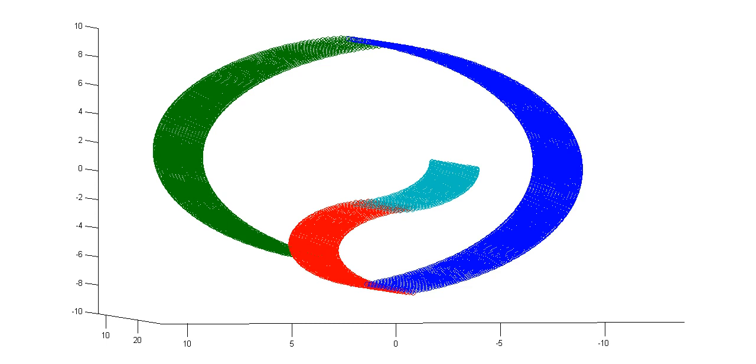We know that in the early areas of the visual cortex, individual neurons respond to different orientations of lines, to different edges, but they generally have similar responses. Cells that are near each other prefer similar orientations, and the voxels are large enough that they're averaging over a lot of the different orientations. So you don't necessarily get voxels that prefer individual orientations, even if all of their component neurons have their own preferences. You can get maybe just small differences in the voxels, but if you look at multiple voxels, you can then have enough information to decode orientation.